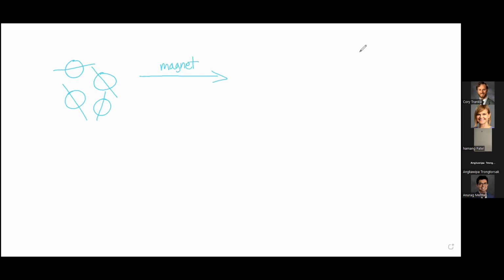what does that do? Well, what it does is it takes all of those protons and their associated spins, and believe it or not, lines them up completely parallel to one another. Every single one in your body. It's pretty fantastic. So, is that how we make the image?